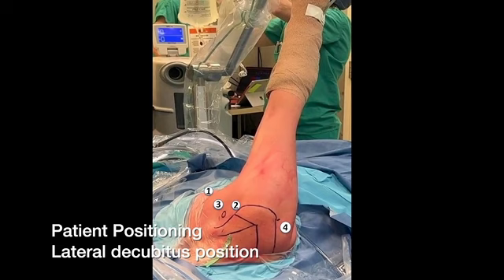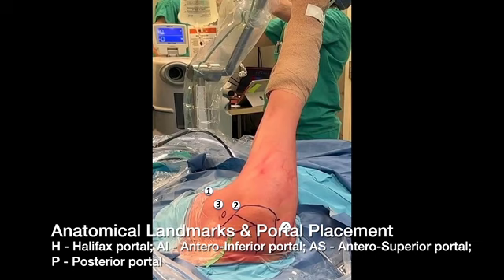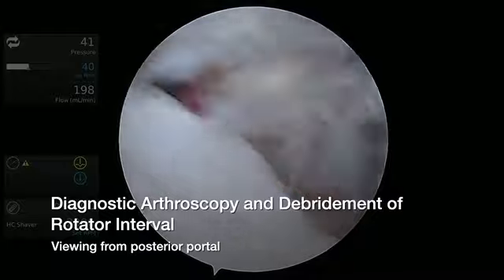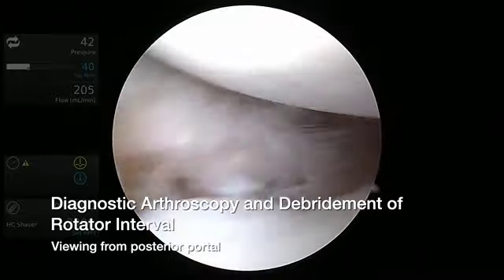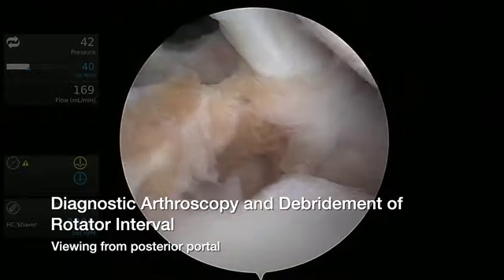The patient is positioned in a 30-degree semilateral position. The 3 standard Bankart repair portals are used with the addition of a posterior inferior portal for Remplissage and the far medial Halifax portal for graft insertion. A standard diagnostic examination of the shoulder joint is done identifying the soft tissue, glenoid, and humeral head bone defects.